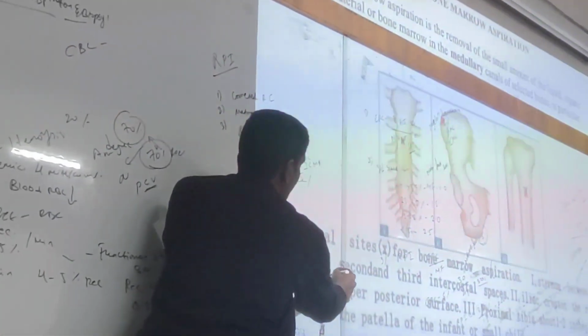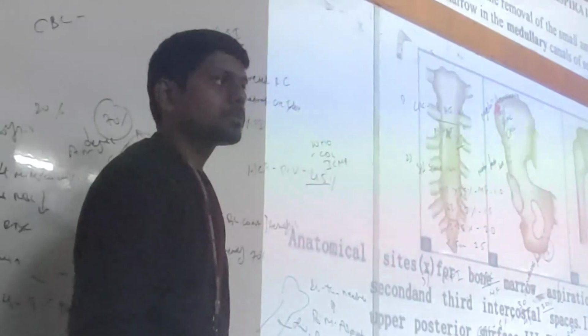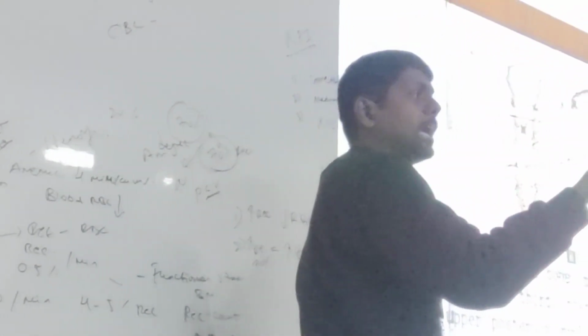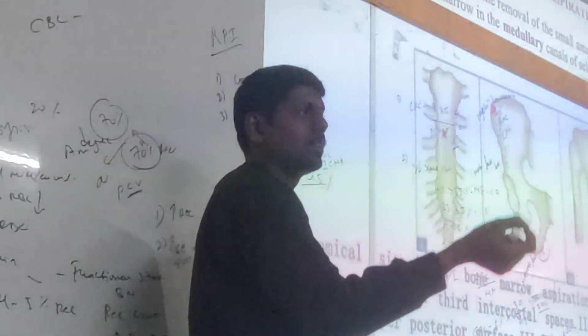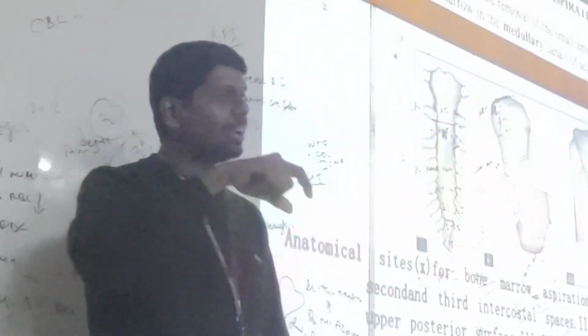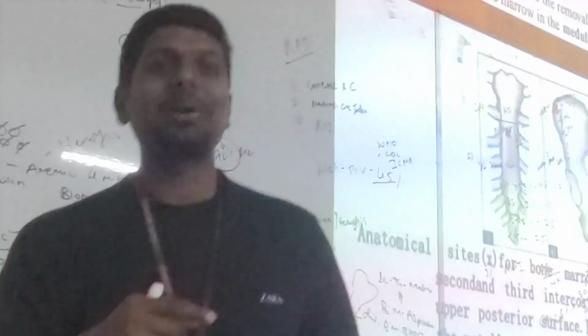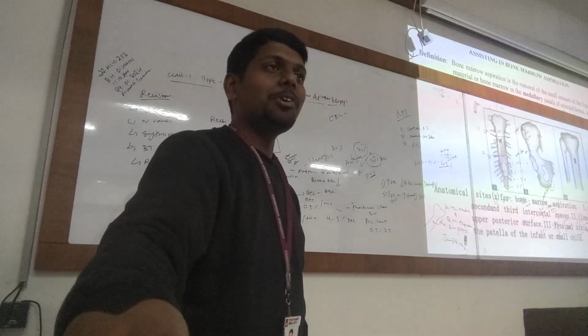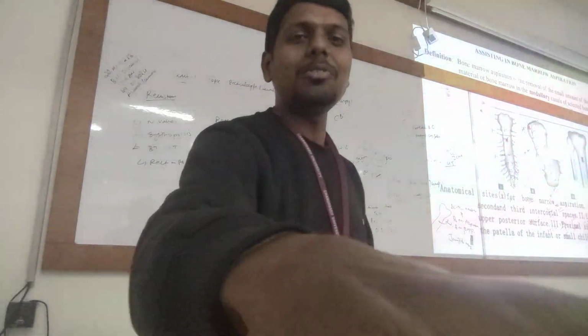I will show what these needles are. Okay. Sir, what is bone marrow biopsy? In bone marrow biopsy, we will take the tissue of the bone marrow. If you are a non-veg eater, then you will understand, right? From chicken bones, you will suck something, right? That is bone marrow. Exactly, the biopsy form of bone marrow. So we are already doing it, all non-veg people.